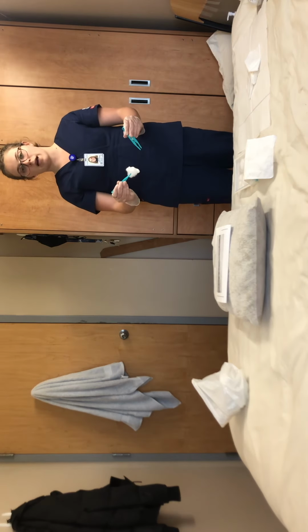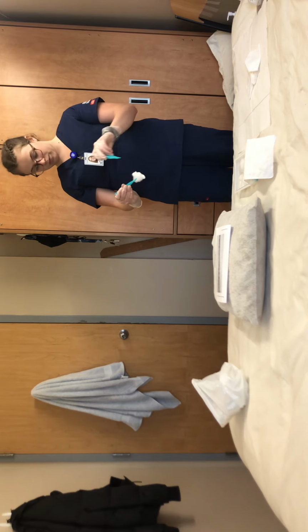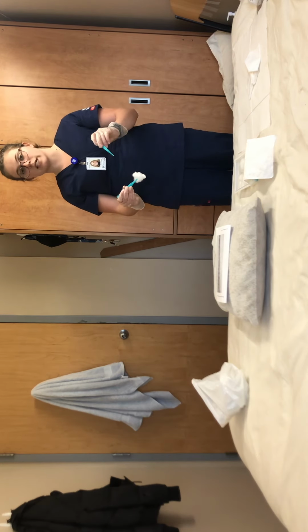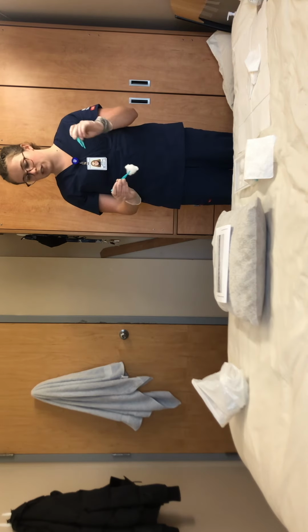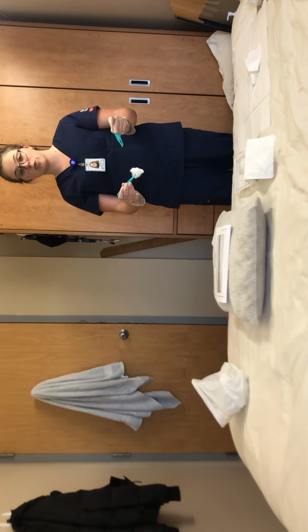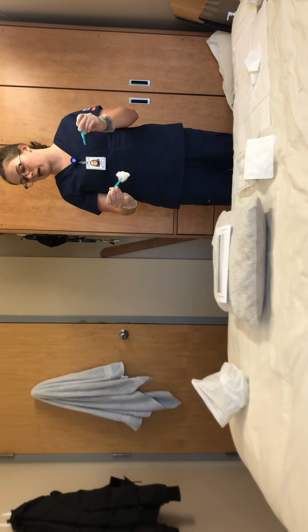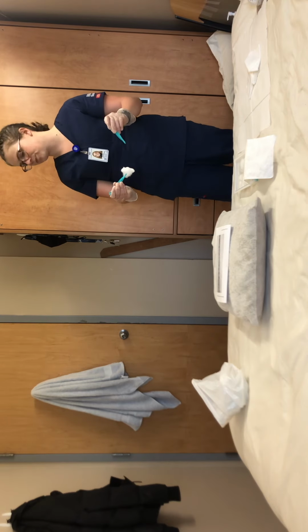And I will be beginning my cleaning of the wound in the middle of the wound, because you would clean from clean to dirty, and the center of the wound is the cleanest portion because it is the farthest away from the unsterile field.